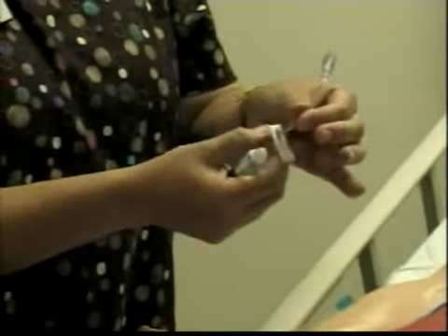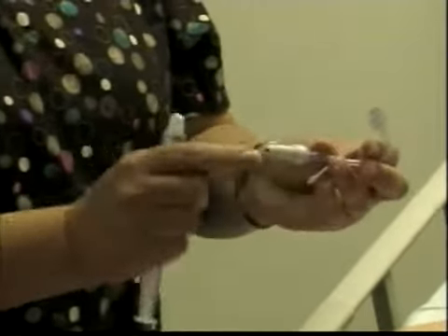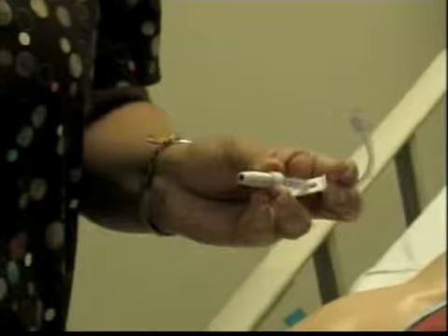You're going to open and connect your saline. Now, if you notice, when I did that, I actually touched that paste right here with my hand. So I'm going to make sure that I clean it so it doesn't get contaminated again. I clean it. I will go ahead and remove the cap.